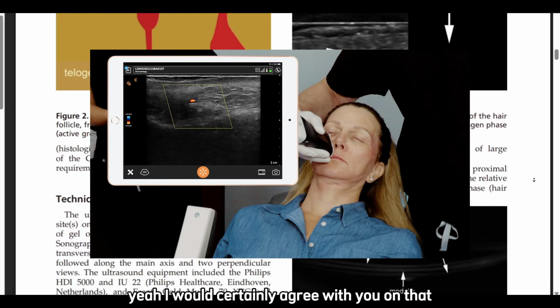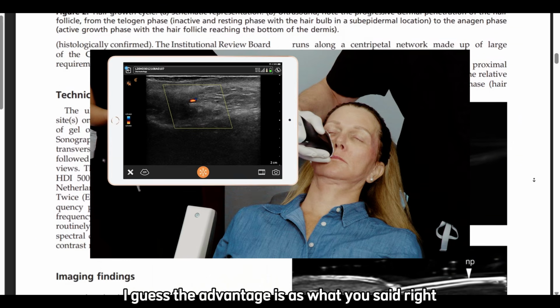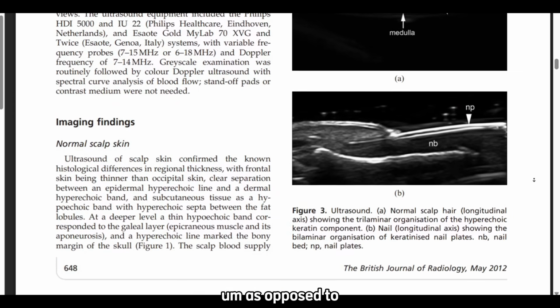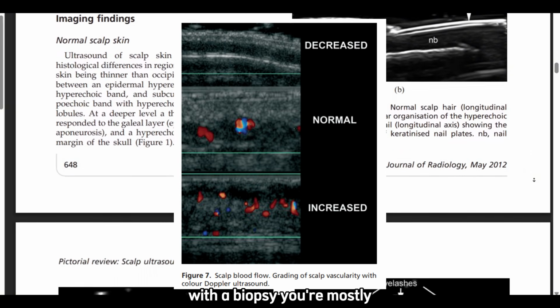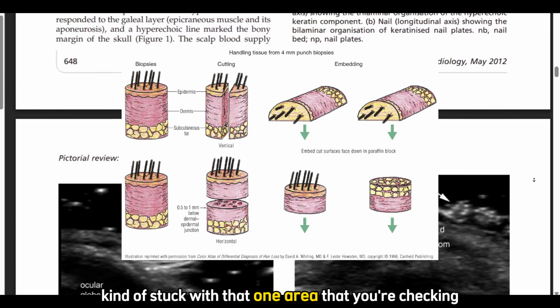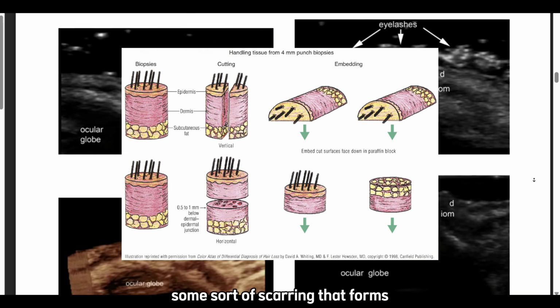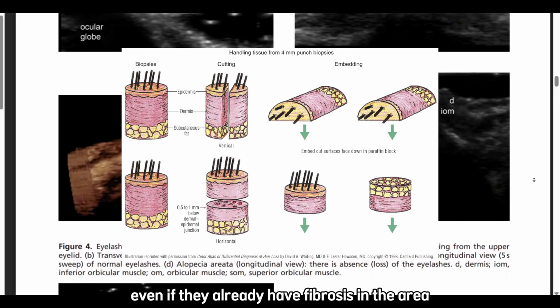Yeah, I would certainly agree with you on that. I guess the advantage is, as you said, that you get to have more insights, and it's never a bad thing to have more data on hand. As opposed to a biopsy, where you're mostly stuck with that one area that you're checking, and there are limitations. After you biopsy that area, you're going to get some sort of scarring that forms. The patient might not like that, even if they already have fibrosis in the area.